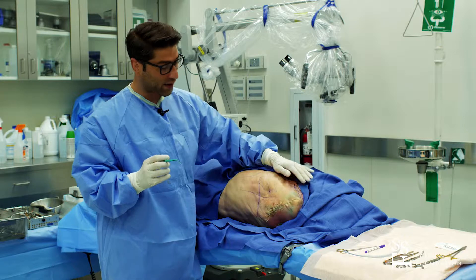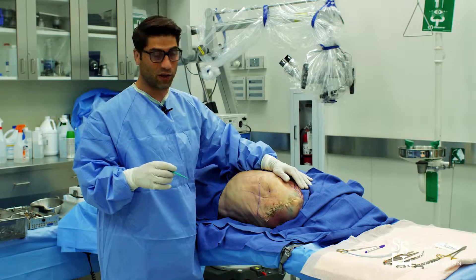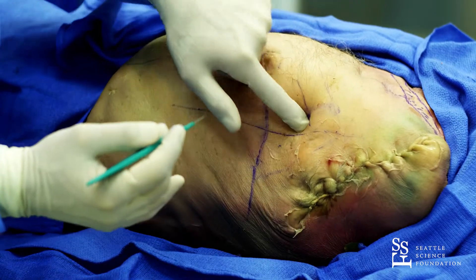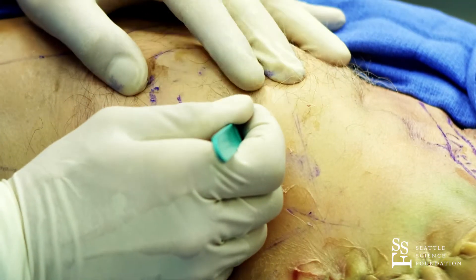When the patient is awake and not under anesthesia, you need some kind of local anesthesia which you apply first in that section. Now I would start to do a skin incision here in the fourth space between the ribs.